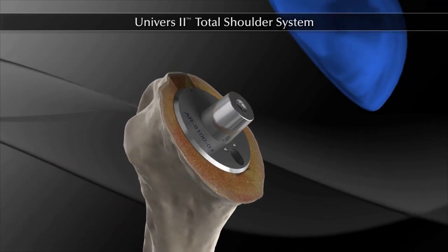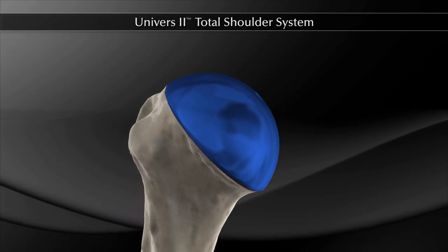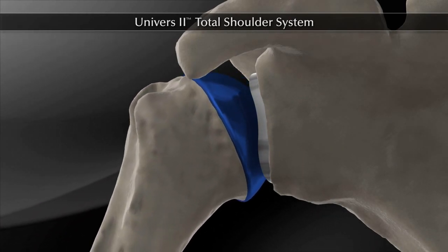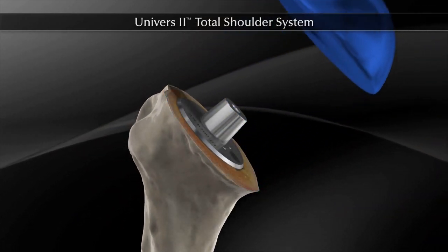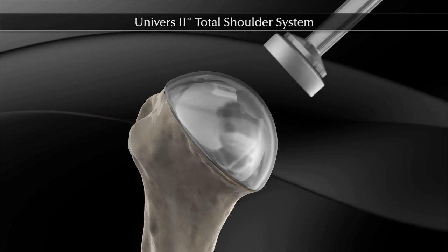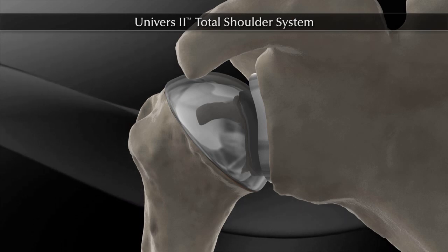The appropriate trial head is chosen, and taking offset into consideration, the head is rotated into the correct position and pushed into place. A trial reduction can now be performed. After the trial reduction, an implant head is rotated to the correct offset and impacted onto the stem using the head impactor. The shoulder is reduced and wound closure is performed per the surgeon's protocol.